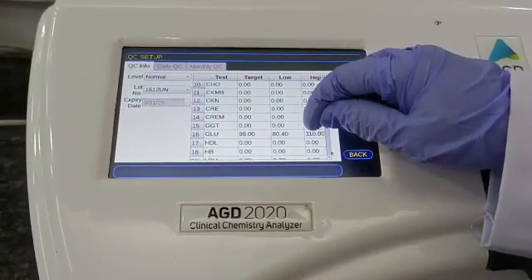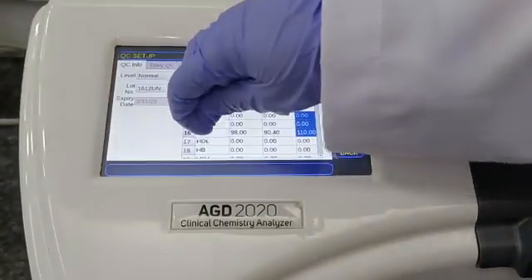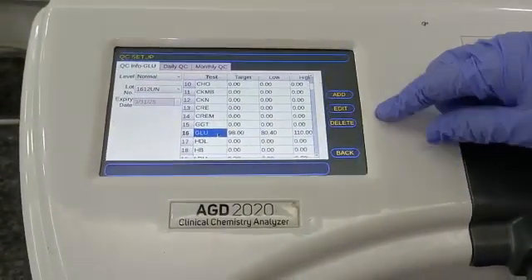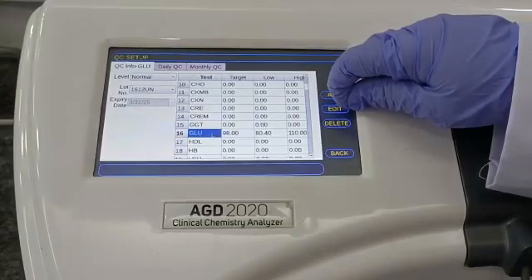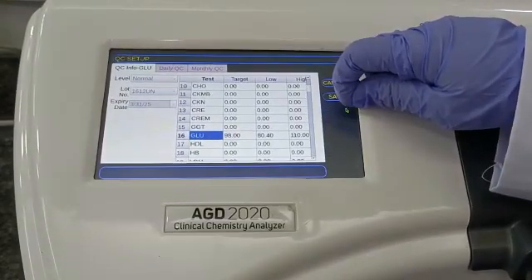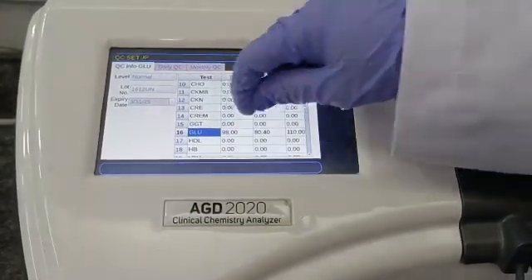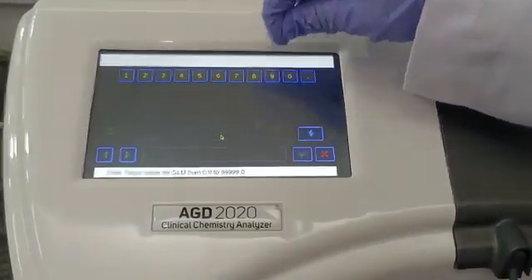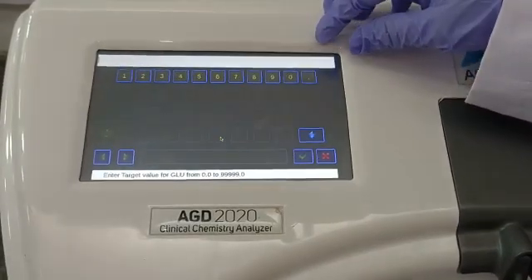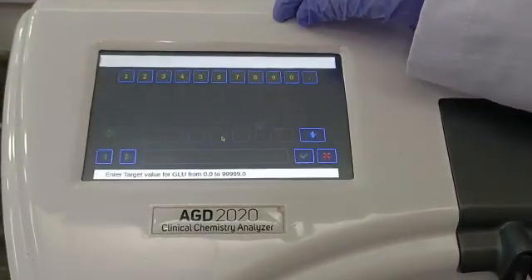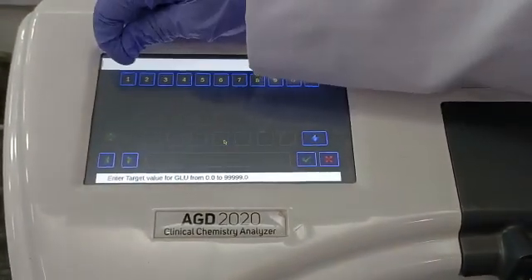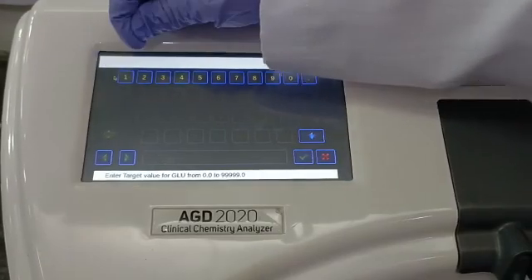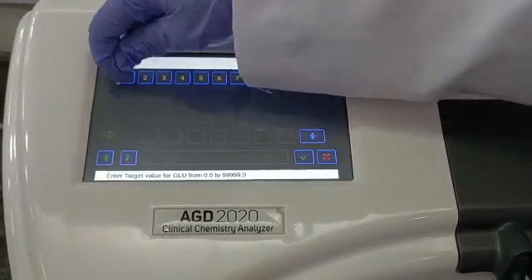Now we will select the test glucose from this table, and we will enter the target values and the SD value as provided in the Randox control value sheet.